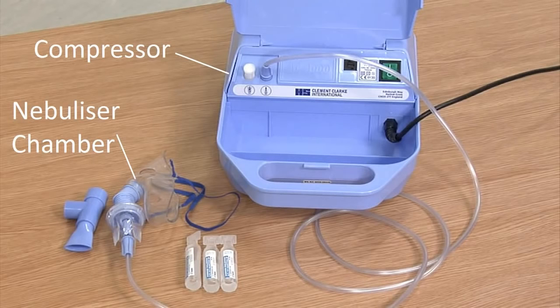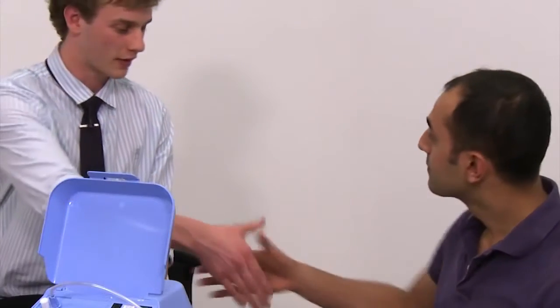It has two main components, the compressor and the nebuliser chamber, and can be used with either a mask or a mouthpiece. As with any procedure, introduce yourself, correctly identify your patient, explain what you're going to do, and gain consent.